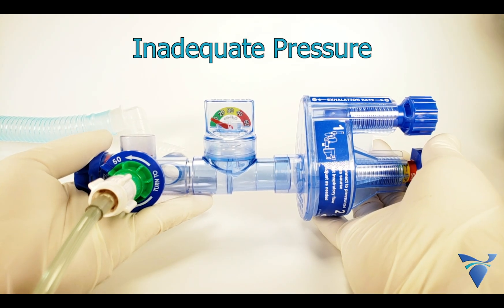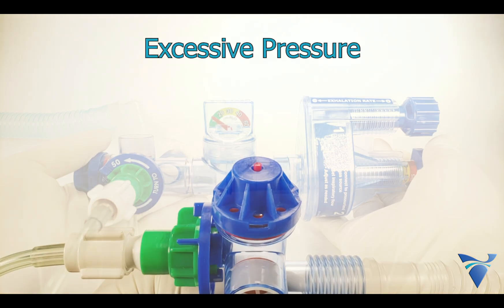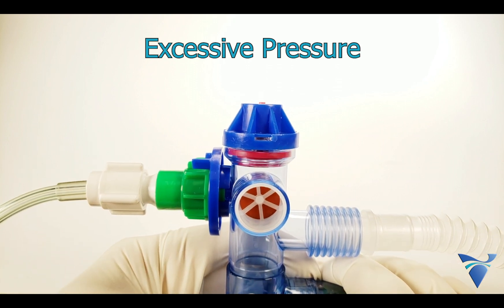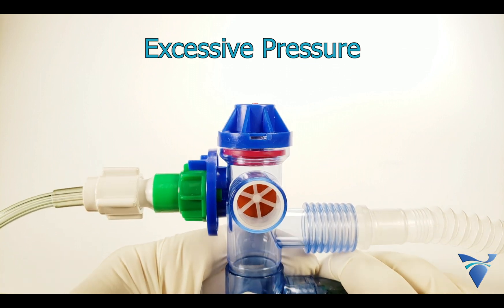Always verify the peak inspiratory pressure on the GoToVent's attached manometer and adjust the pressure dial as needed to ensure the proper tidal volume is set. In case of an obstruction that causes the pressure to build, the device is equipped with a safety pop-off valve that will open if pressures are in excess of 50 centimeters of water.